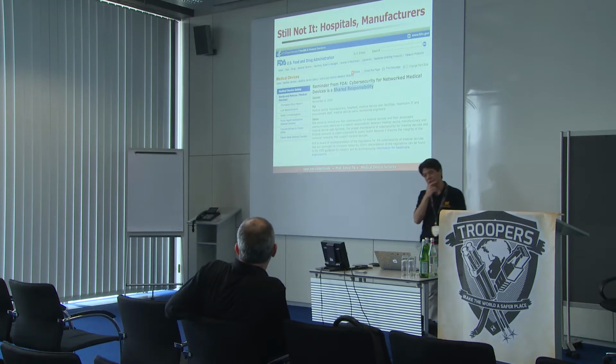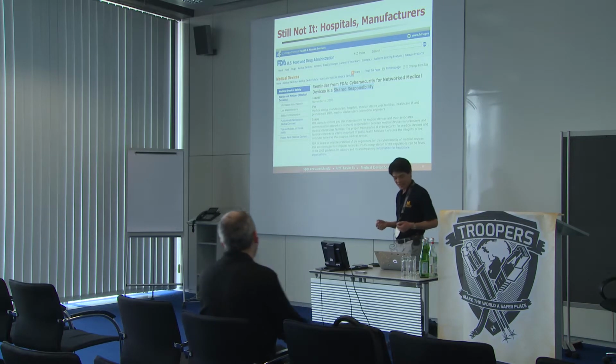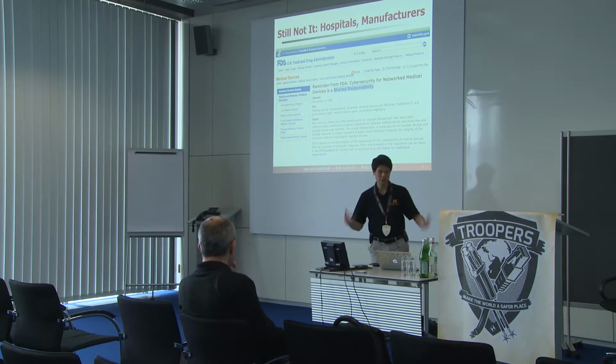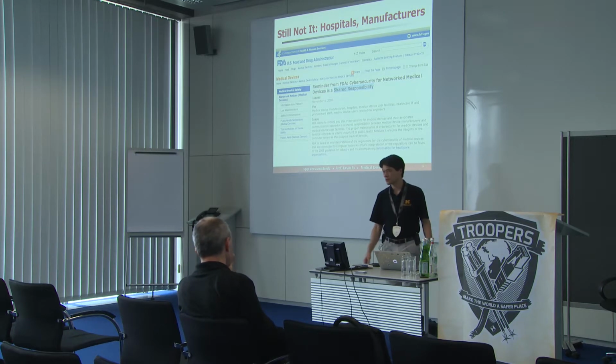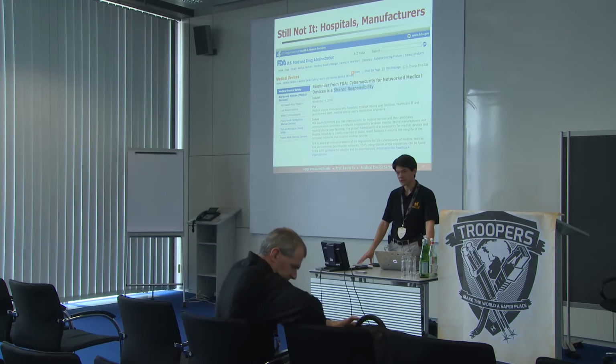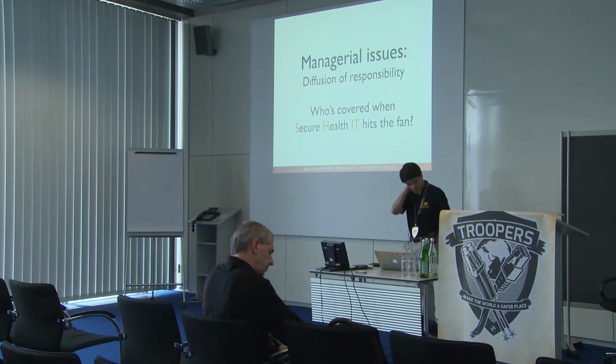So FDA used to issue this guidance that I poked fun at quite a bit called shared responsibility. The Food and Drug Administration would tell manufacturers and hospitals, let's please just get along. Everybody, let's work together. And so, of course, nothing happened, right? They would say, keep your systems up to date. Manufacturers should update their software, and very few manufacturers or providers were able to do actionable things from this. So recently, FDA has issued much, I think, more specific guidance, mostly for the manufacturing side, because that's what they regulate. And I think it will actually improve security. Not solve, but improve. So, managerial issues, who's covered? I think we all are.